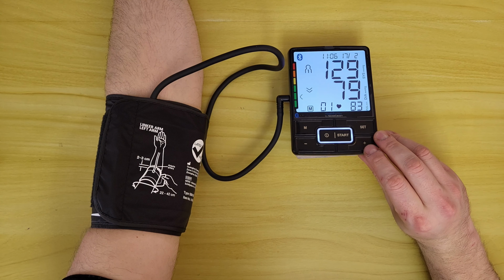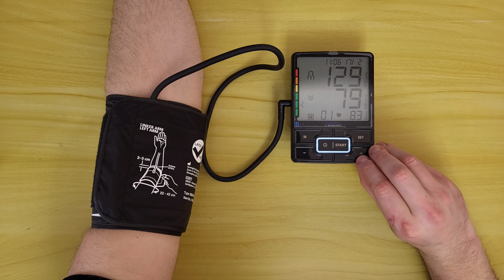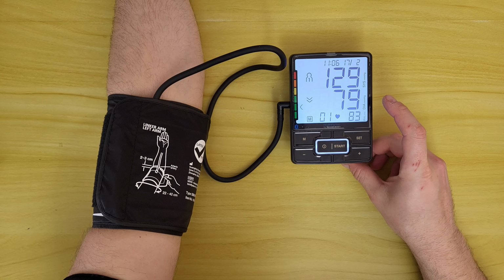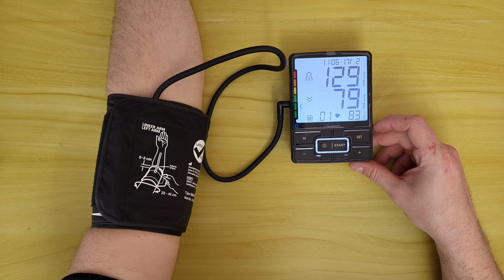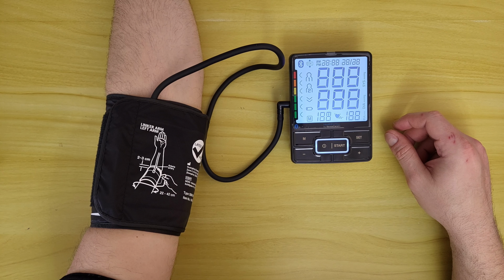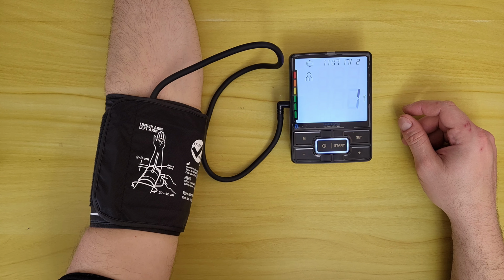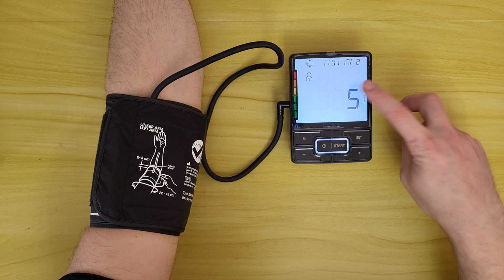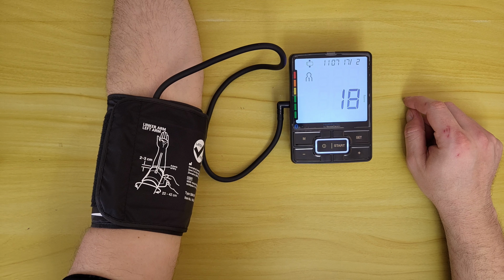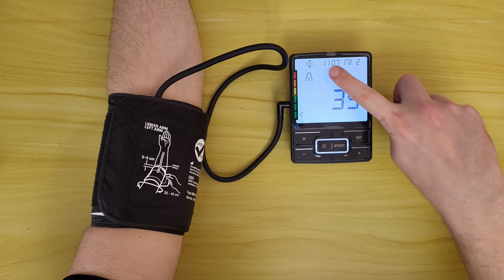And if I move the screen up and down, maybe you can check it better. And we can see here we've got the green. It is the second green. That means it is a very good value. The measurement. Well, let's do it again. Battery icon, everything. Starts again. Checking here for the cuff if it fits perfectly. It is okay now.